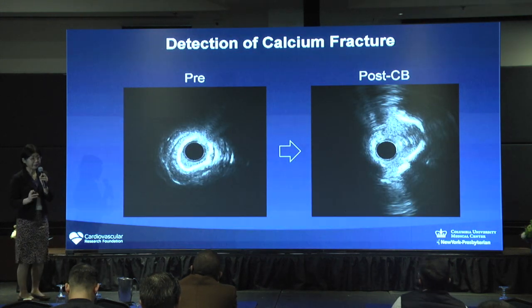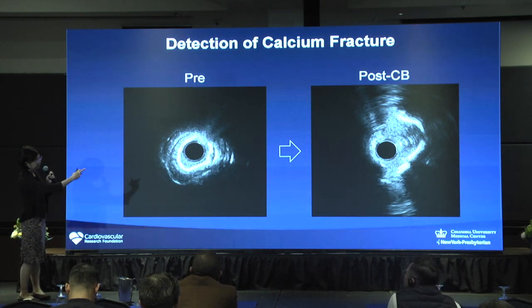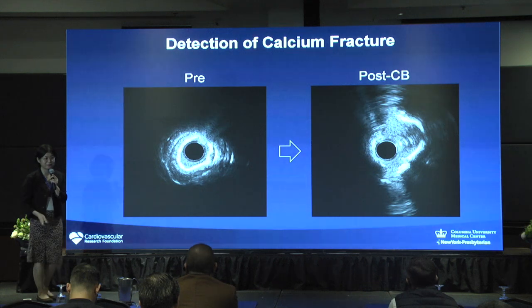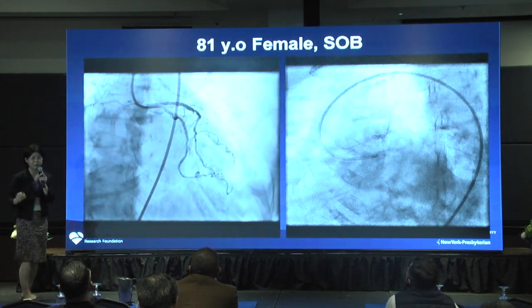When we are talking about calcium, it is important to check the calcium fracture. This is before and after. You see the nice calcium fracture at 6 o'clock and 12 o'clock, right? So please remember this picture. And then I'm going to show two interesting left main cases, how we treat.